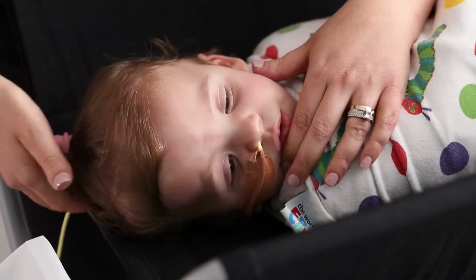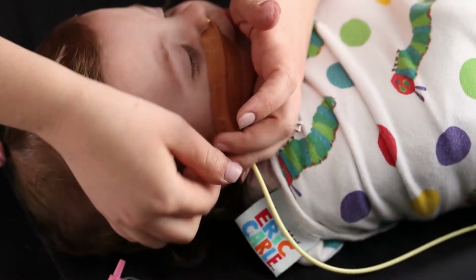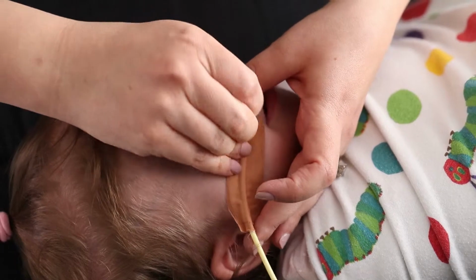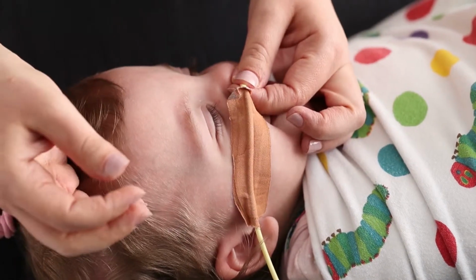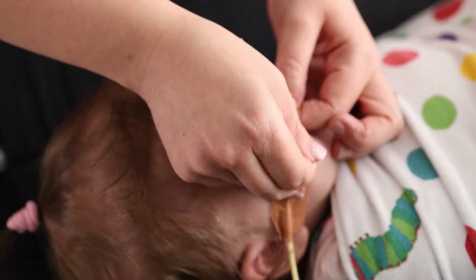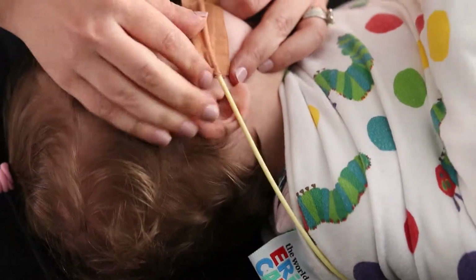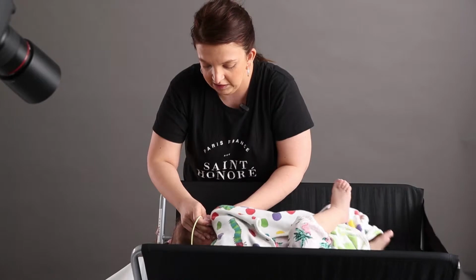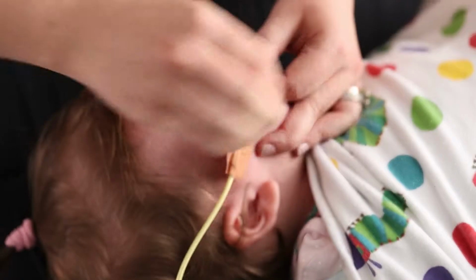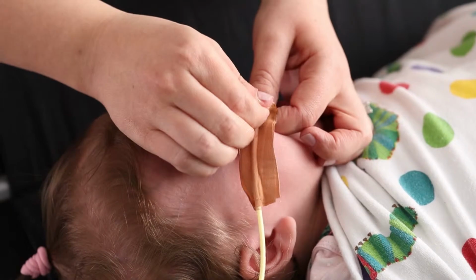Okay, so Emily, we gently turn the head over. What I usually do is put my finger and hold it down. I grab onto the tube so I know roughly the measurement that I have to stick at, and I gently pull off. Good girl, Emily. Now obviously this is a little bit uncomfortable for them as well, so you just have to reassure them that everything's okay. So that's off the skin now. I gently just rip it off.